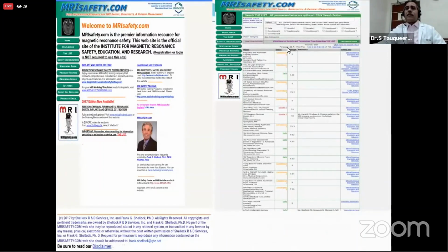This is an interesting website, MRIsafety.com, which is run by Dr. Shellock, and it's a very important website. All the technical staff or radiologists should know about this website, and all kinds of information is there, even about the devices. If you know the name of the device which has been implanted in the patient, you can go and check it. These devices always carry some numbers. You can enter the numbers on this website and see whether these devices are safe to work at 1.5 Tesla or 3 Tesla, whether they are MR conditional or not. One should have all the information from MRIsafety.com. So I would recommend that all the radiology staff visit MRIsafety.com and get some reading material from it.